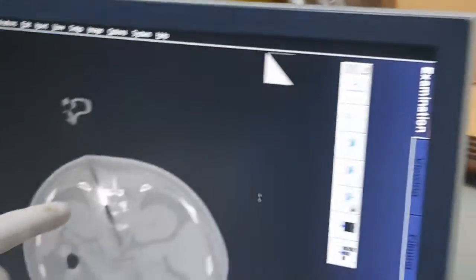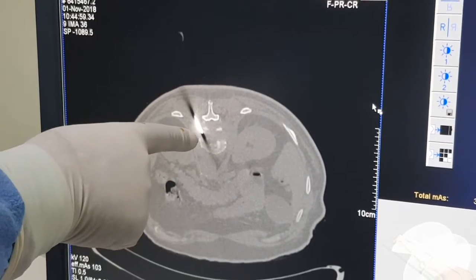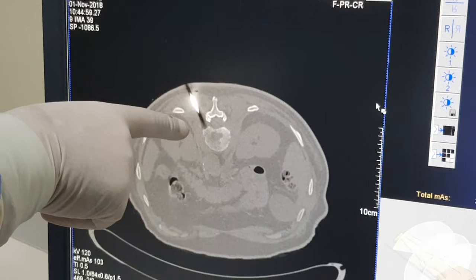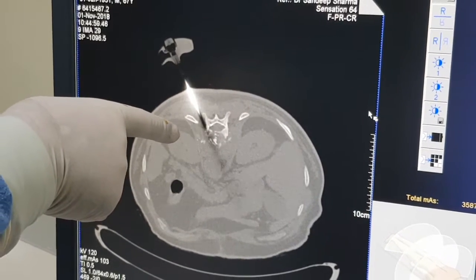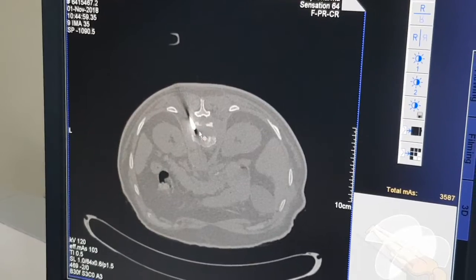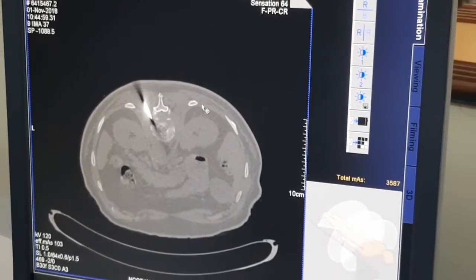We have put two needles — we will show it now. Two needles put into the disc. Show from up to down. This is one into the disc, and the other one is the second one. Make it somewhat thick or 3D, as you showed.